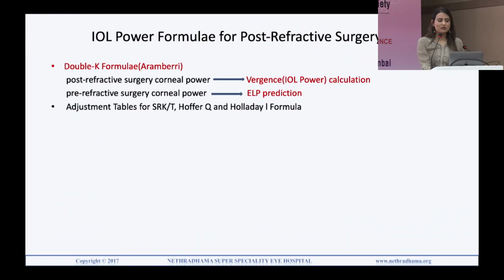Now coming to the different formulae that can be used in post-refractive surgery eyes.